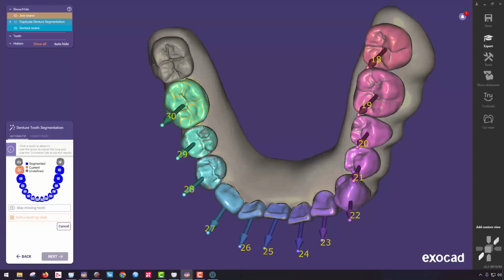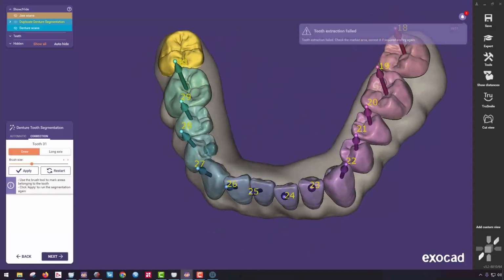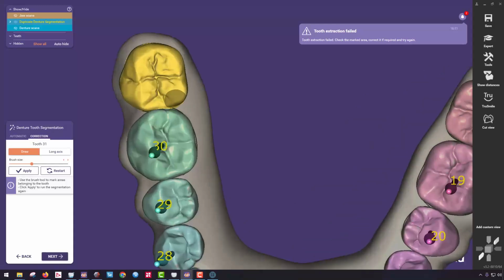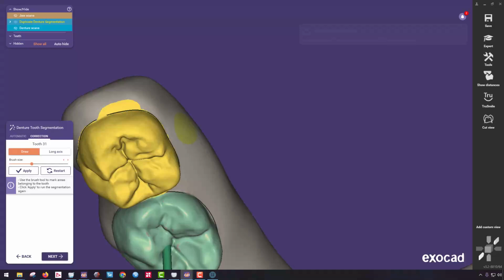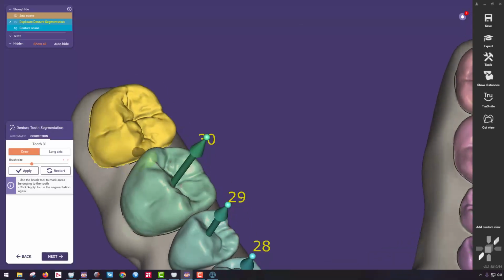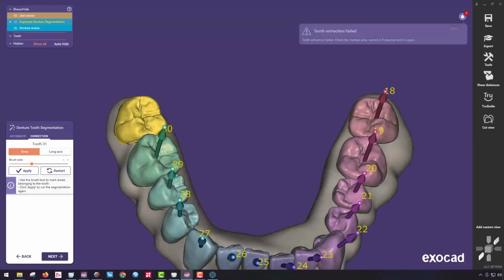And then tooth number 31. Great. Now it looks like it got it all nice and default. So what happens now is if something doesn't look good, I can come in here and tell the software, here's my orientation, or wipe it away using exocad tools. But right in there is what we want to see. Hit the apply button, and usually that fixes it.